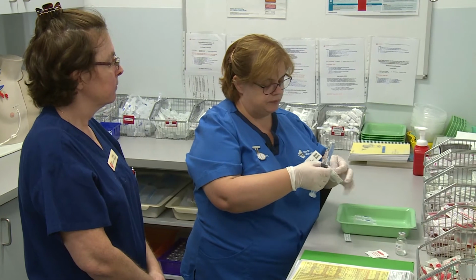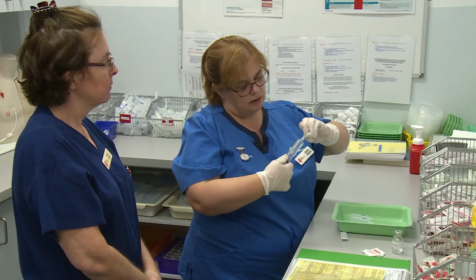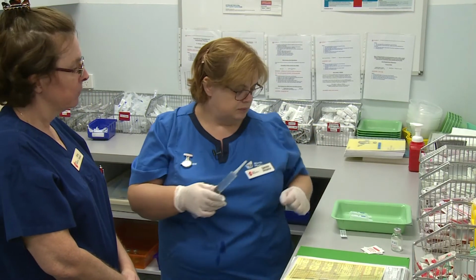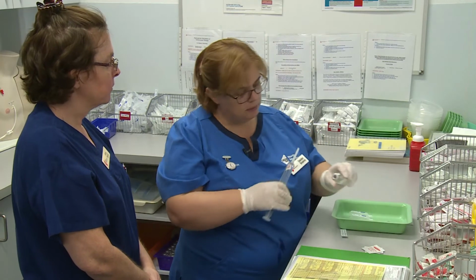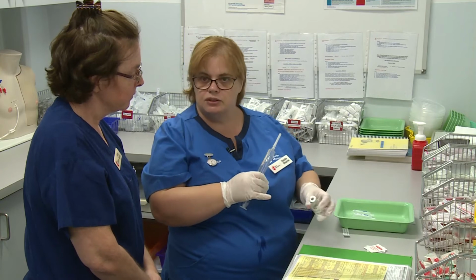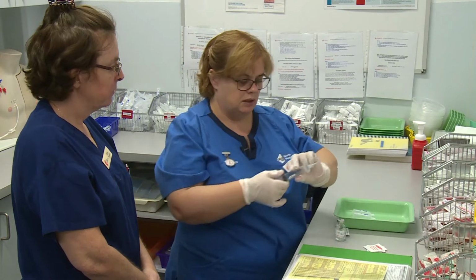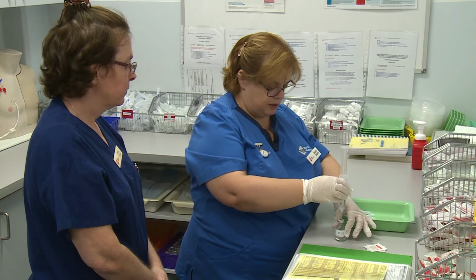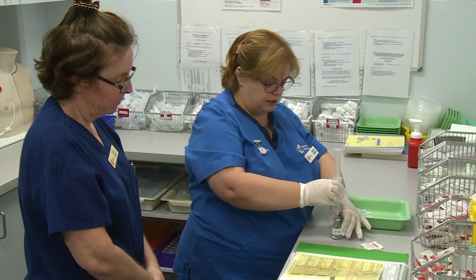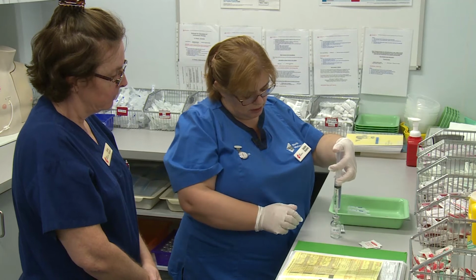So now I've got my vial access cannula, and I'm going to twist that Luer lock on. Alright, so in the middle of my vial, you'll see there's a little circle, so I'm going to aim for the middle of that. And you need a solid surface to put this on because it does need a little bit of oomph to get through. Okay, so now I'm just going to inject my water for injection.